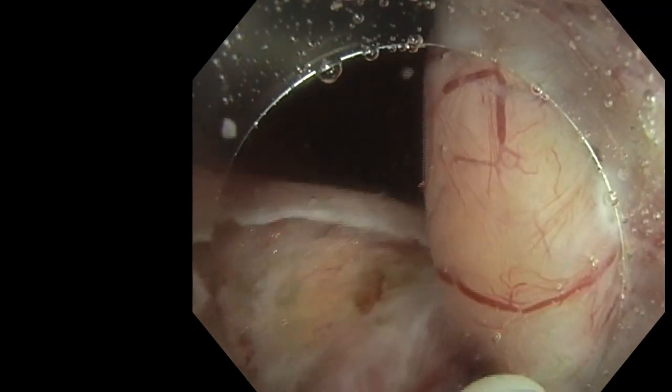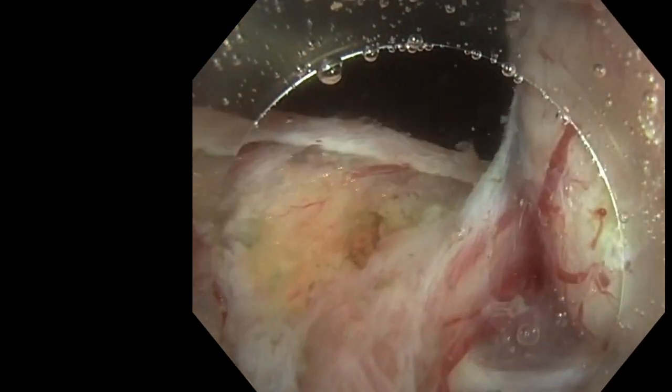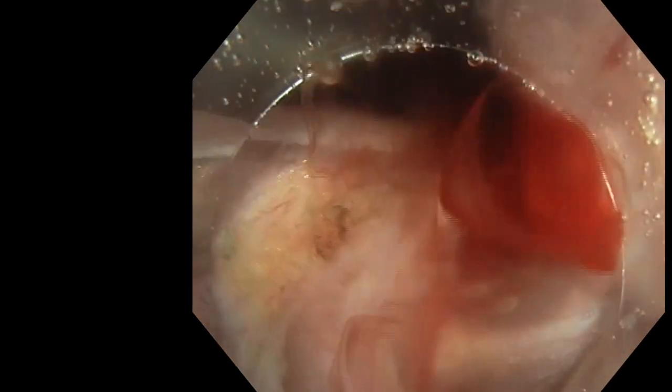It's a little dangerous here because the muscle is in front of us, so we should have lateral movement and not going frontally with a direct view. It's better to turn around, to still turn around. Small bleeding here. I remove the water to see.